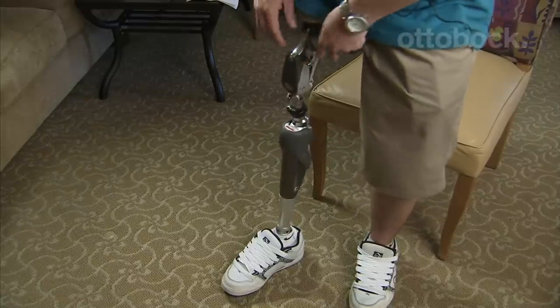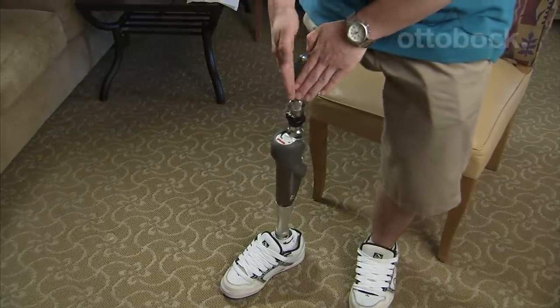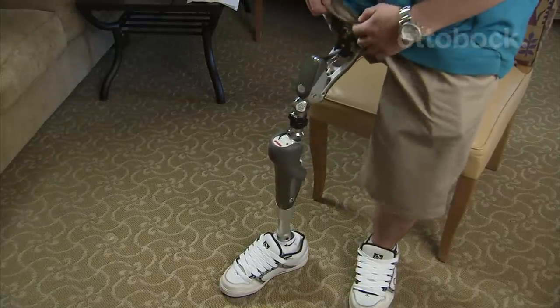Basically, every other hip joint on the market is a modified hinge — no different than just a door hinge attached to a socket. But this hip is polycentric; it has a couple of centers of motion, and it has a hydraulic unit in it.